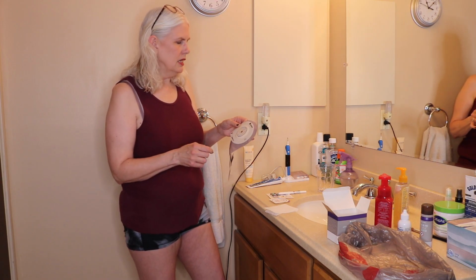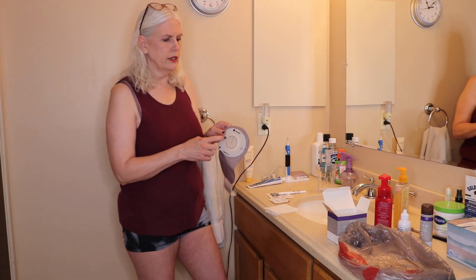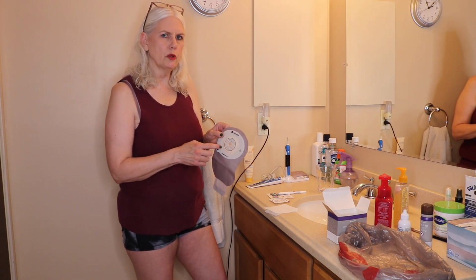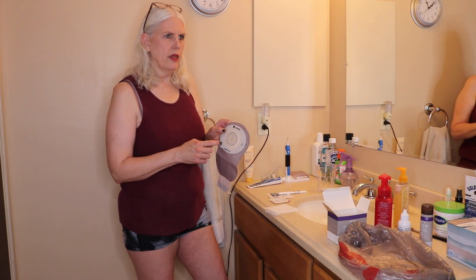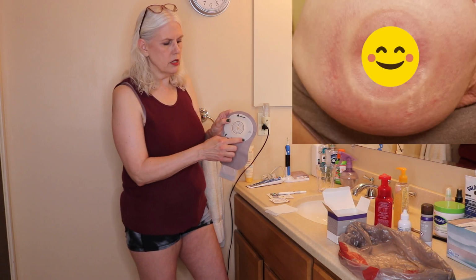So that's nice. The thing for me is with these bags, sometimes this colloidal area, I have a little bit of a skin reaction to it. So the last time that I wore a bag like this, I ended up having a skin rash underneath this part.